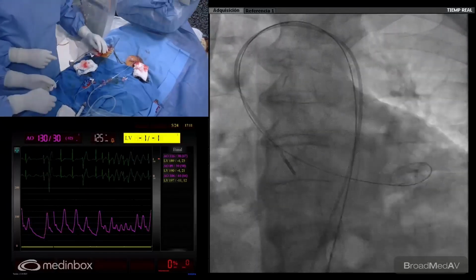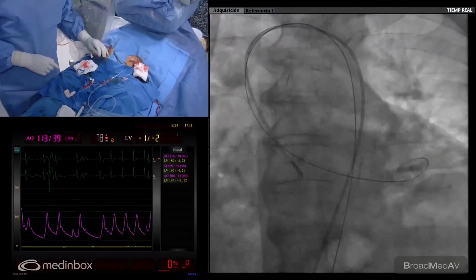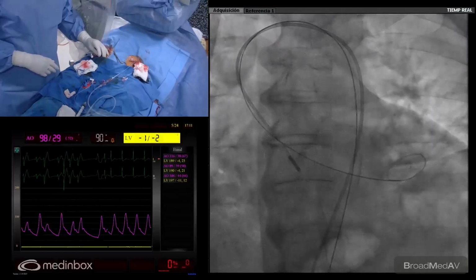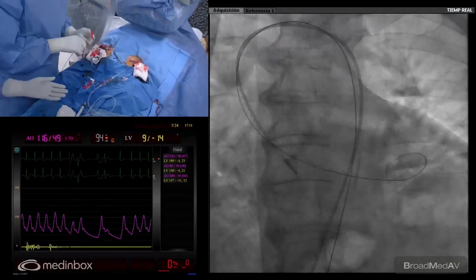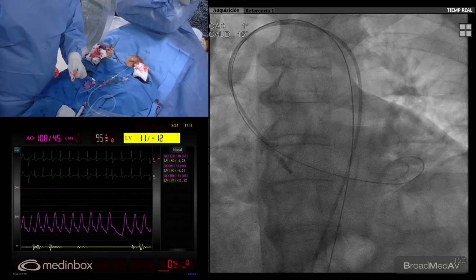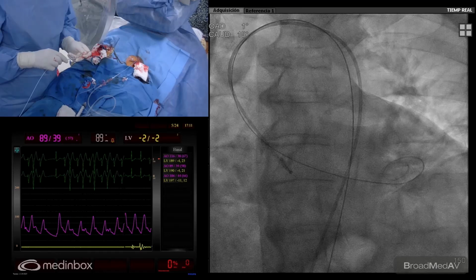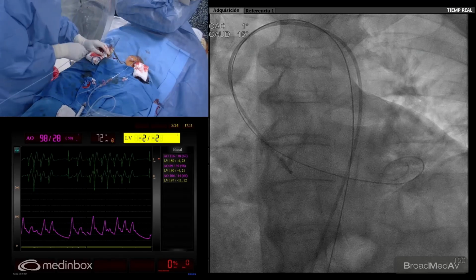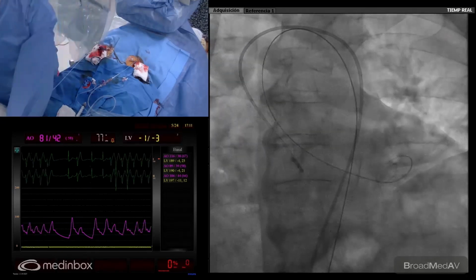Let us please retrieve, leaving the wire as distally as you can. The other issue is we are going to pace him from the wire. We will test during the predilatation. If we don't like it, we can introduce a pacing catheter into the right ventricle as usual. So let's go with the balloon. We have prepared a 20 millimeter balloon, so it's smaller than the sinotubular junction. And we can prepare the valve for crossing and then valve implantation. Yeah, we are going to leave the catheter here.